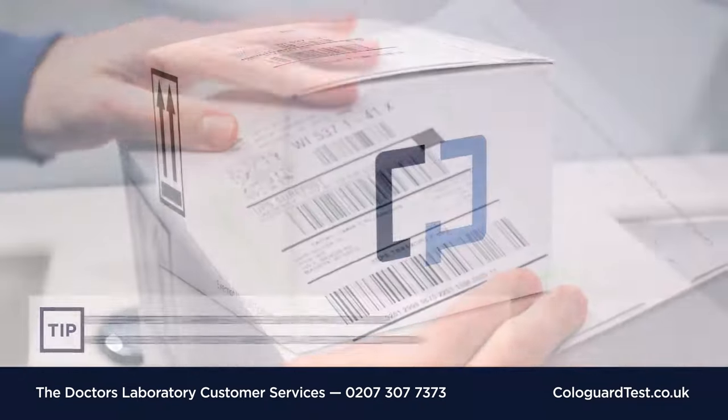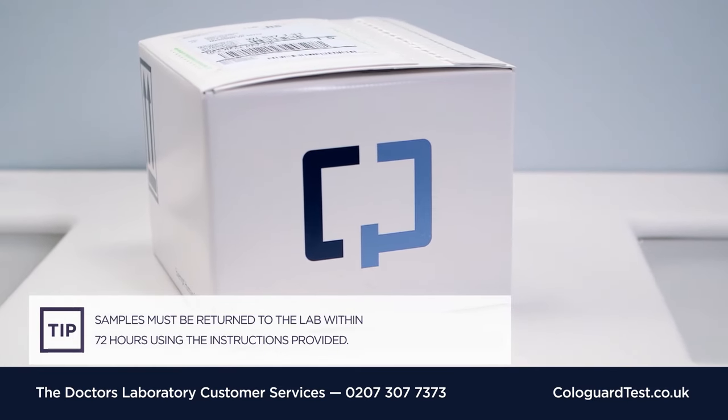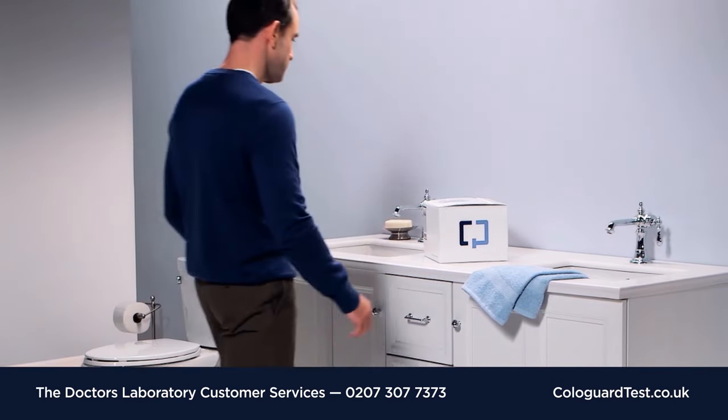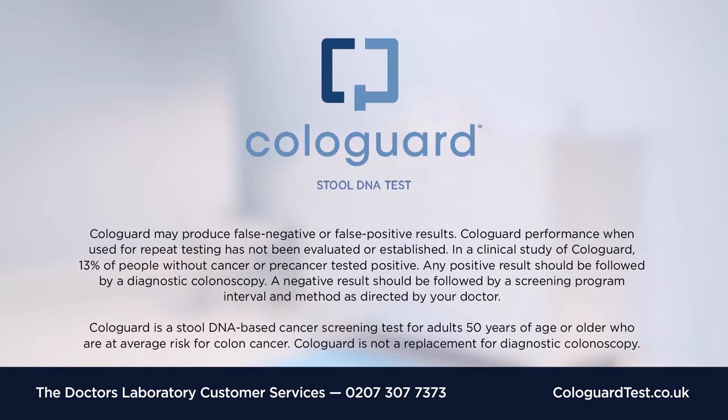The Cologuard collection process is now complete. Samples must be sent to arrive at the lab within 72 hours. To return the sample, please use the instructions provided. Thank you for using the Cologuard stool DNA test.